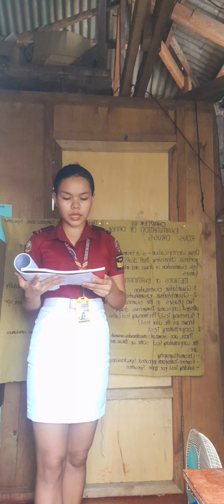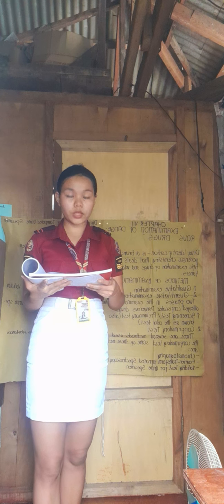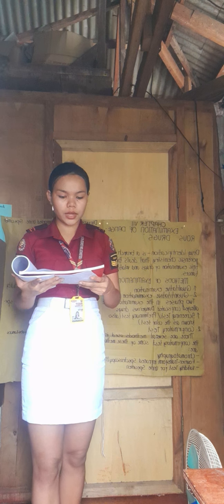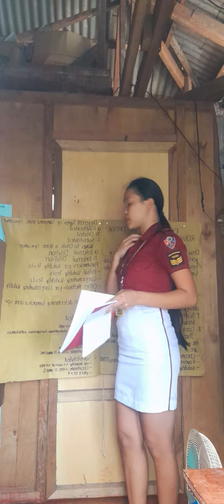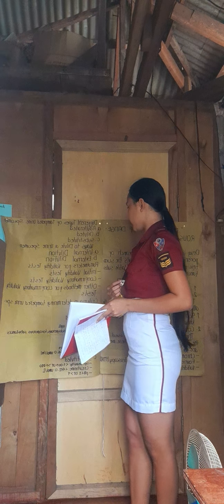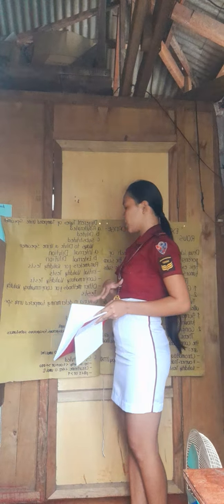When donor is physically unable to go to the laboratory. When donor is involved in a crime scene. When donor is involved in post-accident trauma. When donor is critically ill. So, different types of tampered urine specimen. So there are 3 types. First is adulterated, second is diluted, and third is substituted.